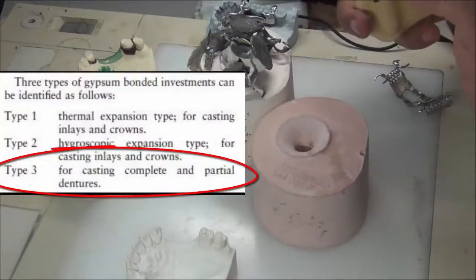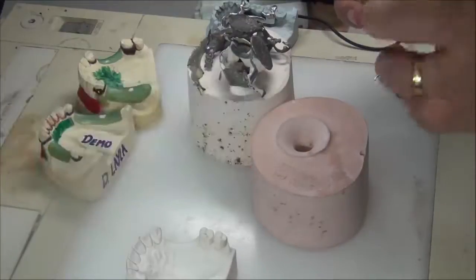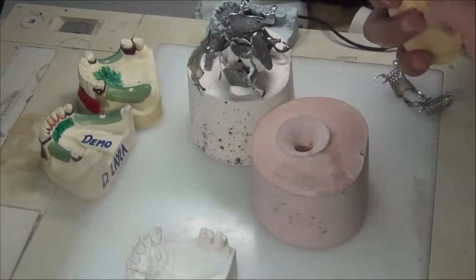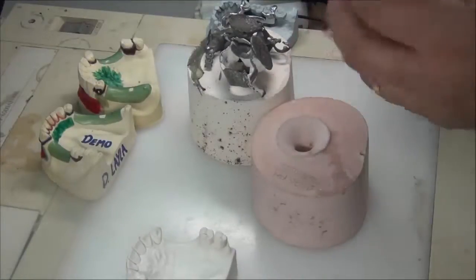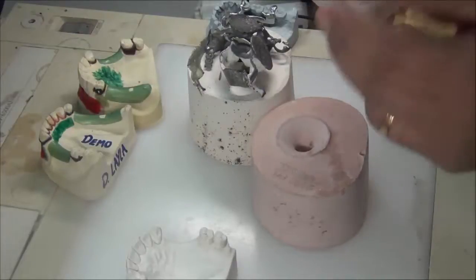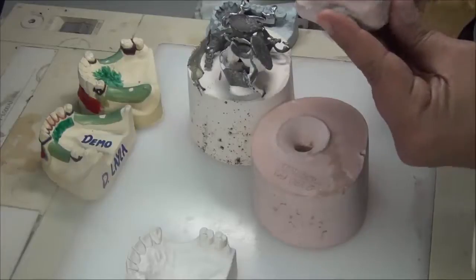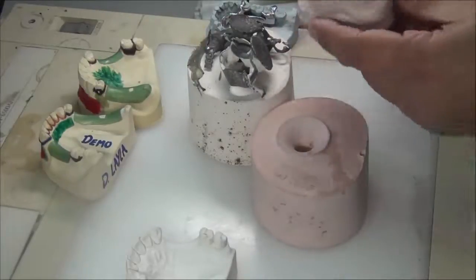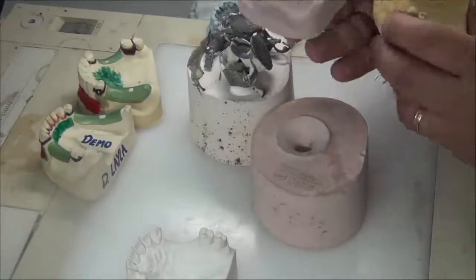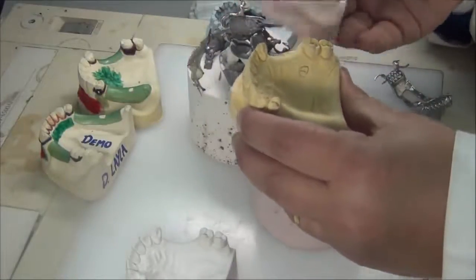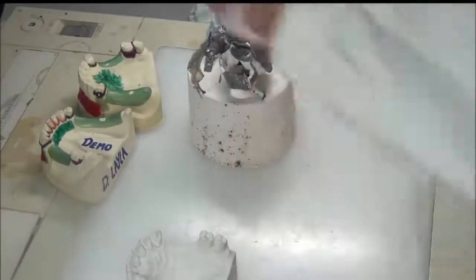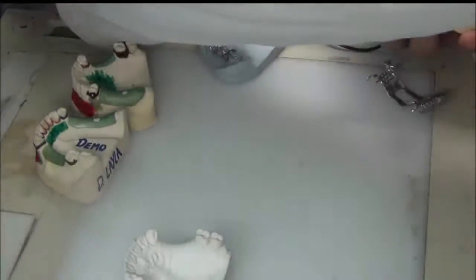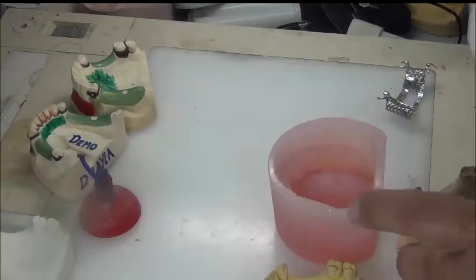Refractory cast material is a specific type of gypsum — not regular gypsum — with some binder between the gypsum particles. This cast has very low abrasion resistance: it is very weak and fragile. We strengthen it with beeswax and then add our wax patterns. To convert the secondary cast into a refractory cast, I do a process called duplication before putting in the wax for the metal.